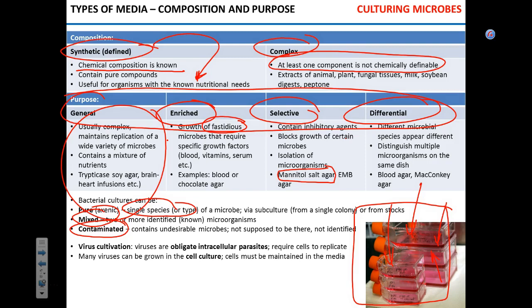It may sound really trivial, the cell culture, but if you think about it, the only alternative to growing cells in a flask is to use animals, which makes it really expensive.